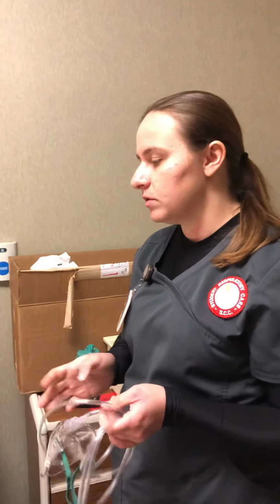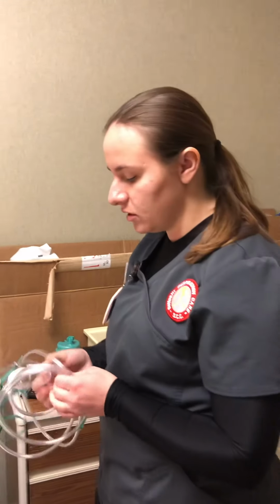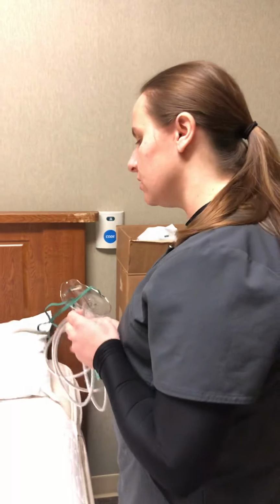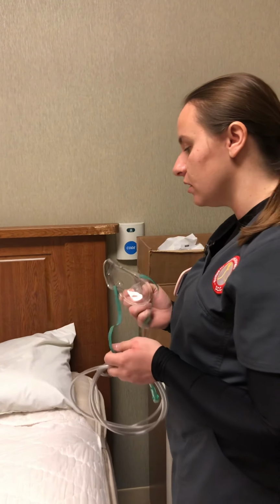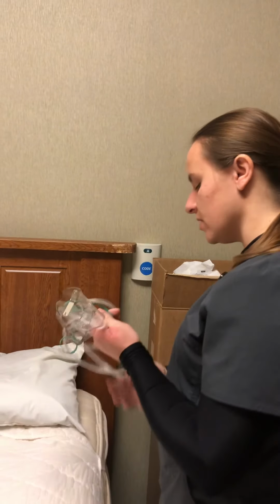So when I'm ready, I'll introduce myself and then I would check their ID band and also get their vital signs before I place them onto the oxygen. Hi, alright, so the doctor has ordered for you to be placed on oxygen. So this is just a plain simple mask that's just going to go over your face just to get you that oxygen that you need to get your O2 levels back up, okay, and stabilized.